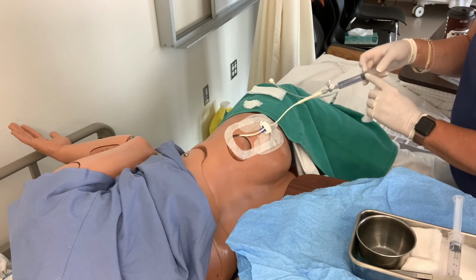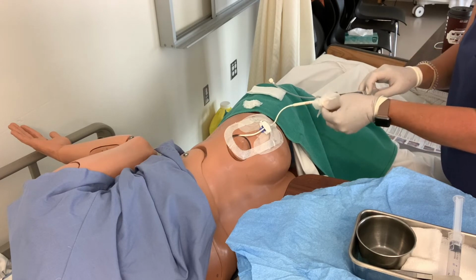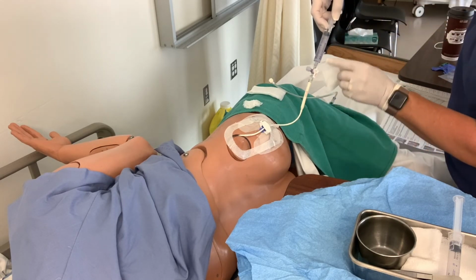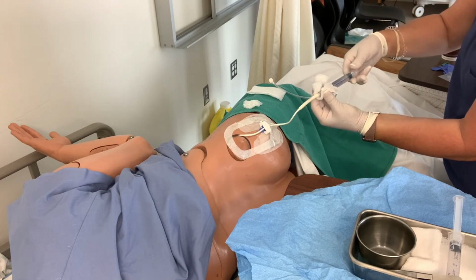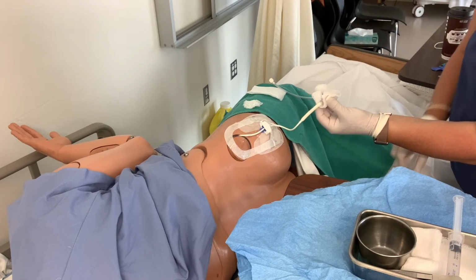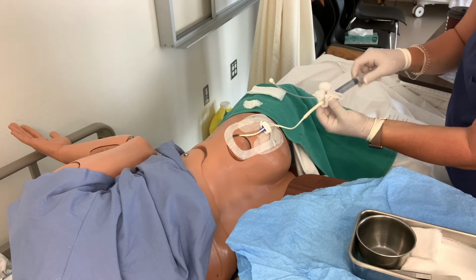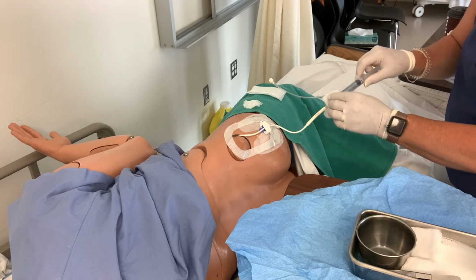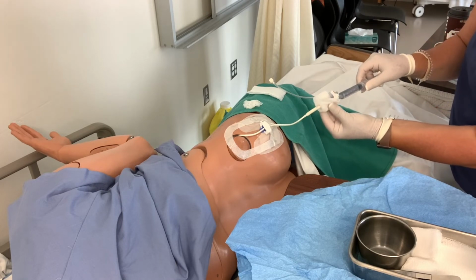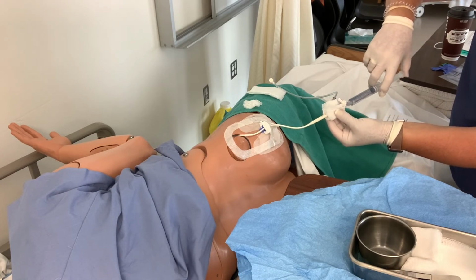So once I have that whole 10 put in, I'm going to turn the stopcock off, because the patient has to be off. And I'm going to take off, hang on to the stopcock. This has been inserted, so this one's gone. I pick up this guy, pop it on, open the stopcock, hold the tube, push, pause, push, pause, push, pause, so a 20 ml flush.